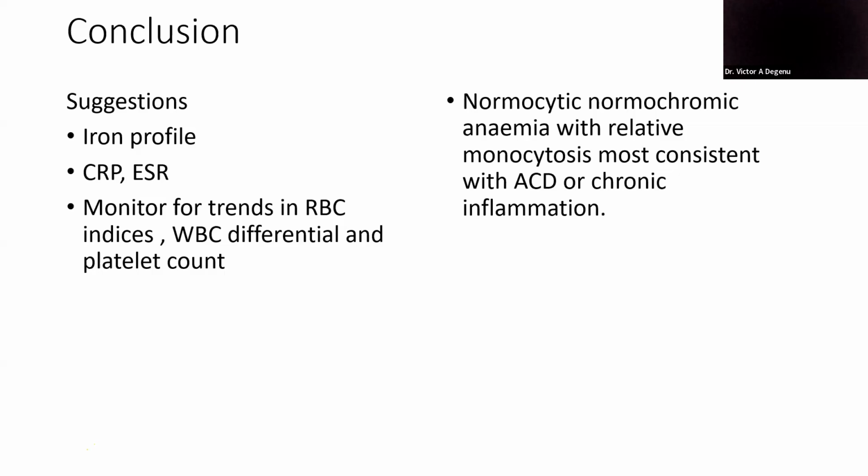So we are gradually getting to the end of our presentation tonight. I think I have the last slide to present. So this is it. Total WBC 1.15. Various absolute values and then the percentage. Then we have HB parameters and RBC indices.